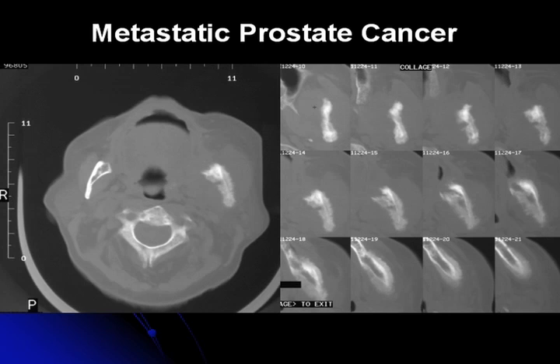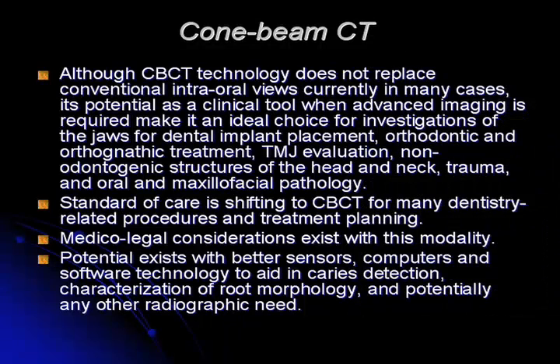So when you see a weird lesion of the posterior mandible, and it has this hair-on-end look, or it's an ill-defined ragged radiolucency, these are kind of red flags that go off for clinicians. And they may or may not be symptomatic. In this case, this was asymptomatic, and this was the first diagnosis that this could be metastatic disease. And when this was biopsied, it actually was consistent with metastatic prostate cancer. The patient was thought to be in remission, but with this identified, it was found that they were not.